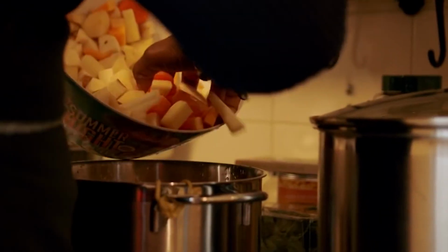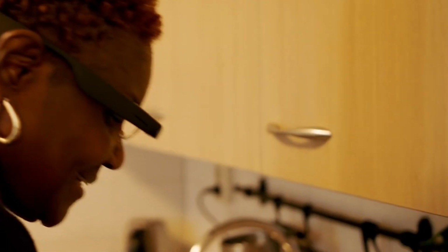That's when we realized how crucial this whole hands-free thing was, because people use it, for example, to help them fill out their tax forms. They call a friend or a family member and fill out forms online. Or if they're trying to cook something, they call a friend or a family member and ask them questions, like, am I adding the right amount of salt? Or can you read this out to me? And wherever the AI cannot really help, or wherever the AI fails, humans can step in and fill in the gap.